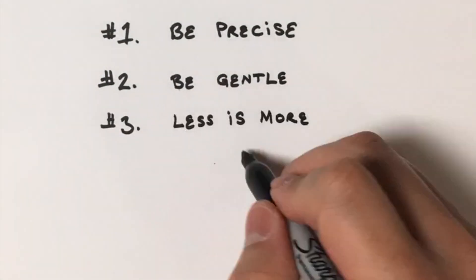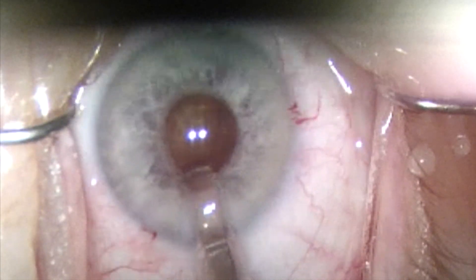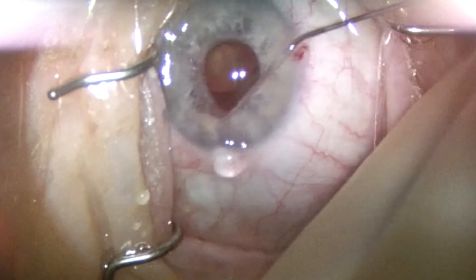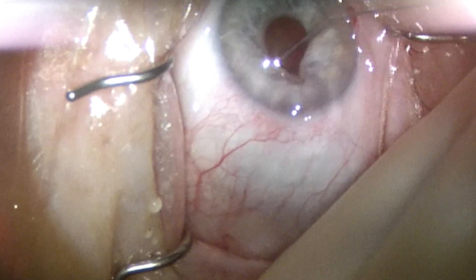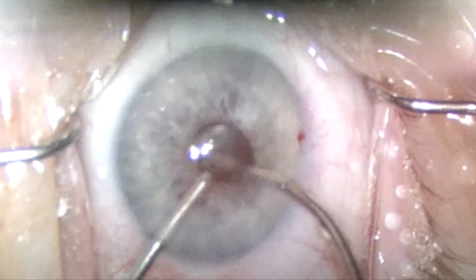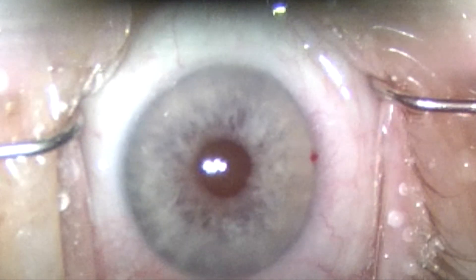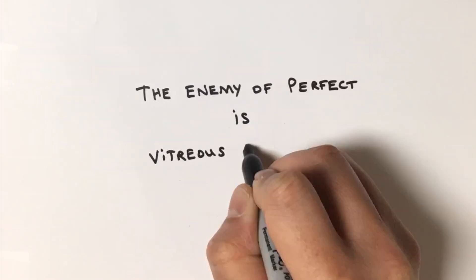Tip number three: Less is more — know when to stop. Avoid the overuse of viscoelastic, as the increased intraocular pressure will force iris prolapse through the main incision. If it occurs, use an alternate paracentesis to lower the eye pressure and then use viscoelastic to reposition the iris. At some point, when the pupil is just too small to continue, know that it's okay to stop. There's no place for pride in the operating room. You don't have to place an iris expansion device all on the same day and risk tearing your anterior capsulorhexis. After all, the enemy of good is perfect, and the enemy of perfect is vitreous loss.